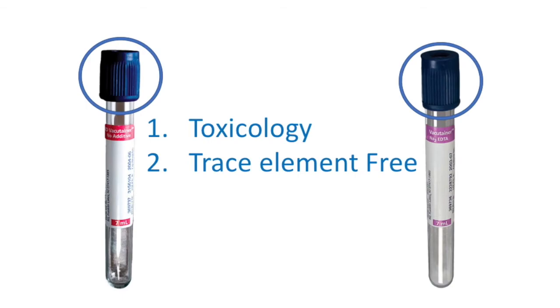Does that make sense? These are trace element free. That's why they go to the toxicology department. So we can test for arsenic poisoning, drug poisoning, things like that in the toxicology department.